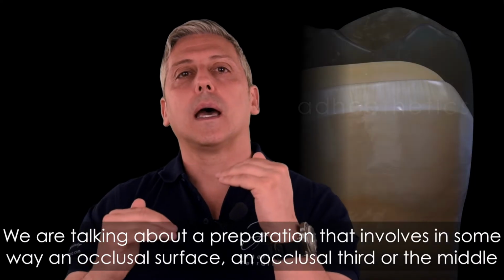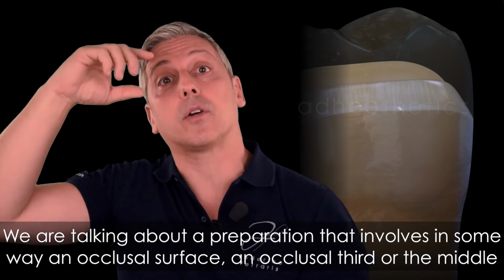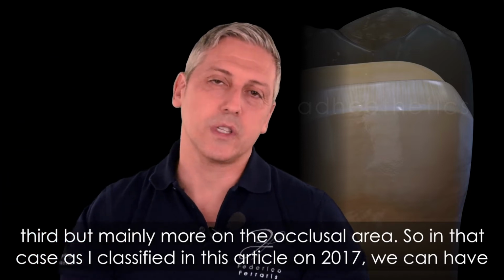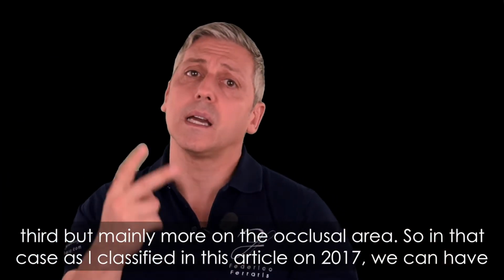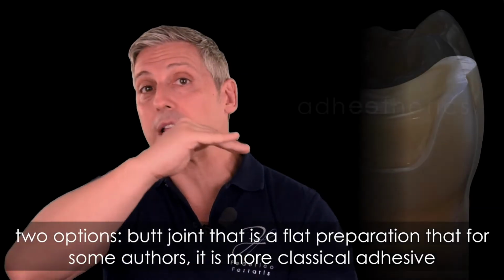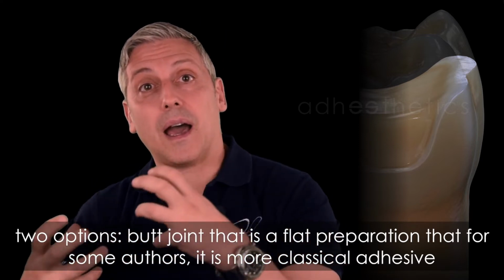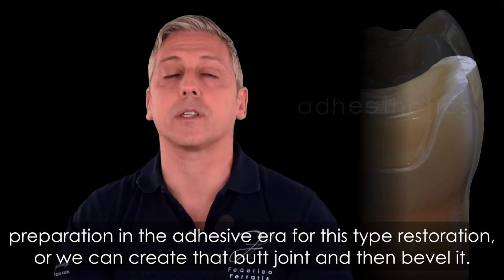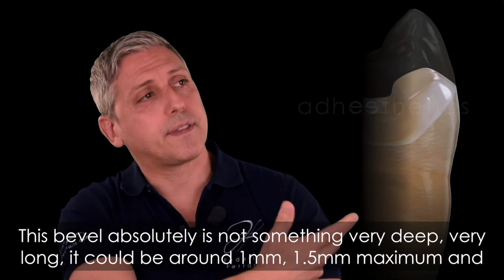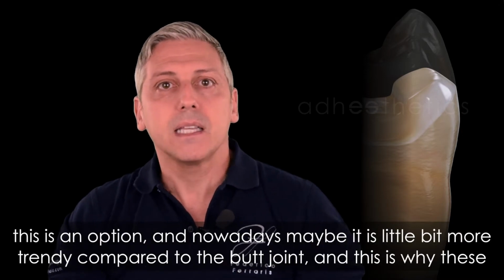We are talking about a preparation that involves an occlusal surface, the occlusal third or the middle third, but mainly the occlusal area. In that case, as I classified in the 2017 article, we can have two options. The butt joint, a flat preparation that for some authors is the more classical adhesive preparation for this type of restoration, or we can create that butt joint and then bevel it. This bevel is absolutely not very deep or long. It could be around 1 millimeter, 1.5 millimeters maximum. And this is an option.